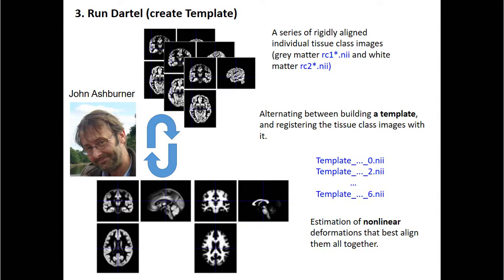And there will be a number of iterations in order to generate this template. It's like you normalize, you fit to each other, you average up, then you try to fit even better. That's why you have this loop here, and this man is responsible for all this cleverness. And I cannot tell more about the internal logic of this system, but he can.